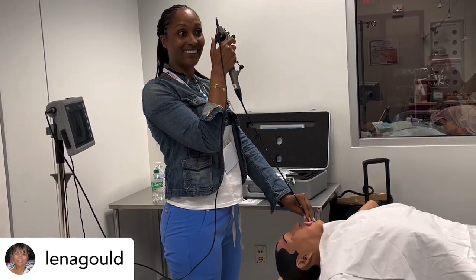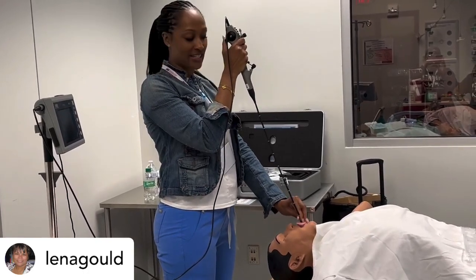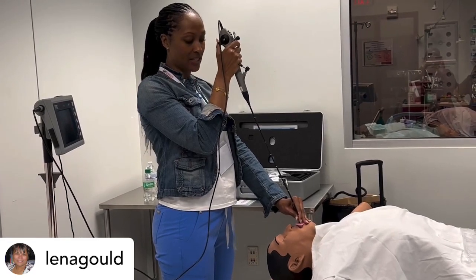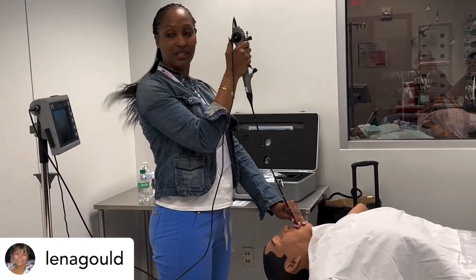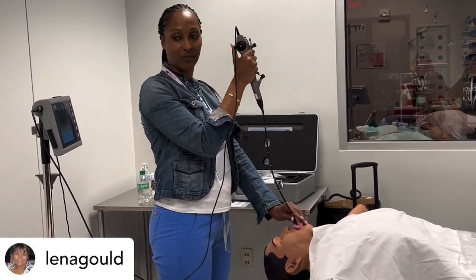What do you see? The cords! We're going to go right through there. We advance, and see how I'm using my finger, my hand here to kind of bridge me, to support me, and then I'm using the up and down. If I need to go right and left, I can do this pretty fast because I do thoracic cases at work.